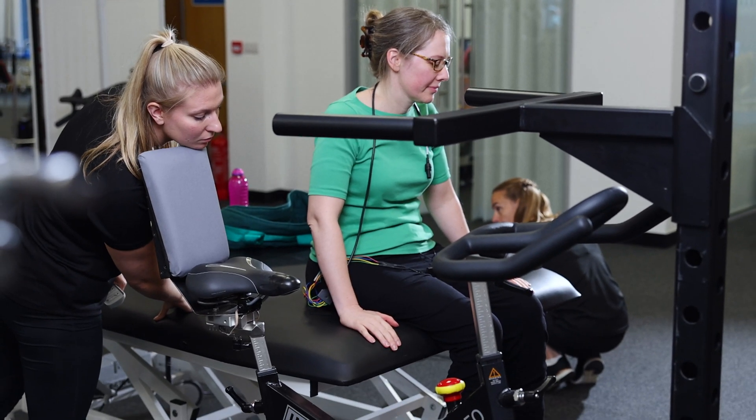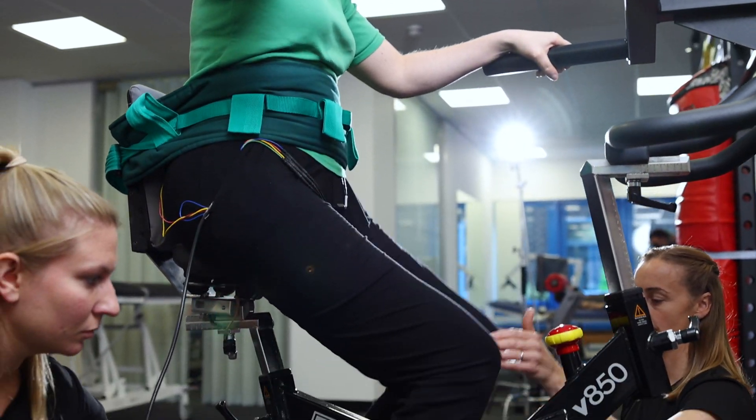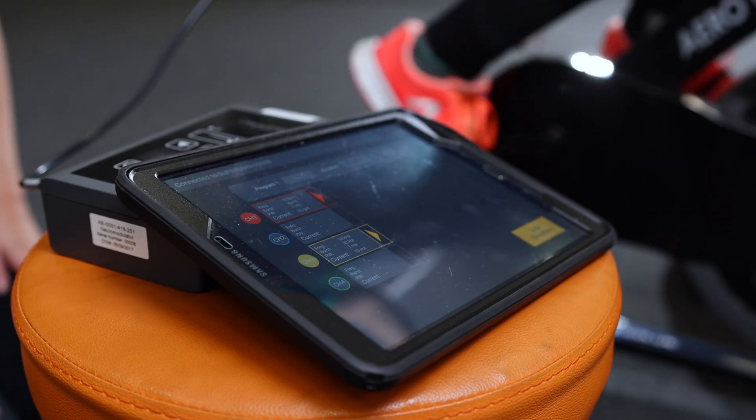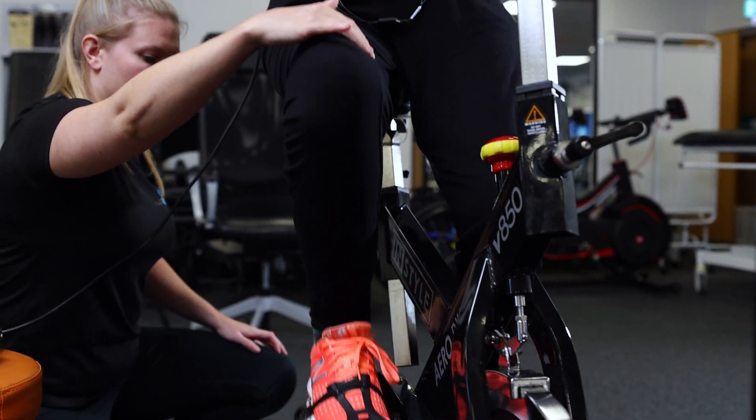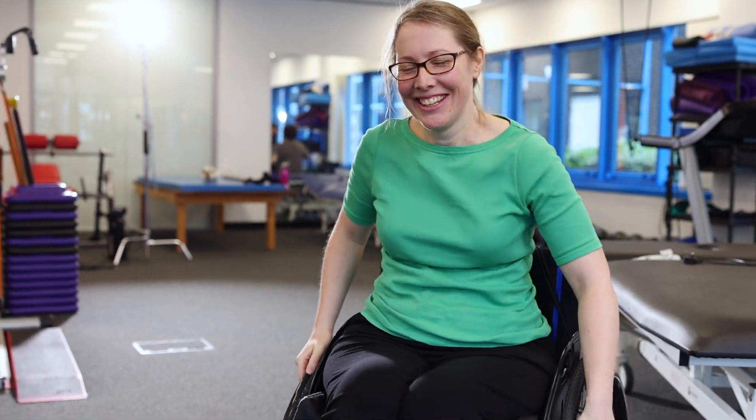This research study with the Onward ARC stimulator is the most exciting opportunity I've had whilst working in spinal cord injury rehabilitation. It has the potential to be a game changer, and we're hoping that it's a real breakthrough for people with spinal cord injury.